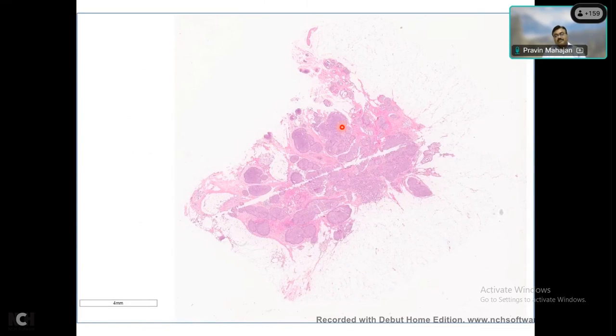This is another example of solid papillary carcinoma. You can make out on the scanner image that there are different size nodules, which are forming a definite mass, which must be around 2 centimeter size, and you don't see that these are infiltrating into the adjacent fat. The stroma looks not so reactive, at least on this power.